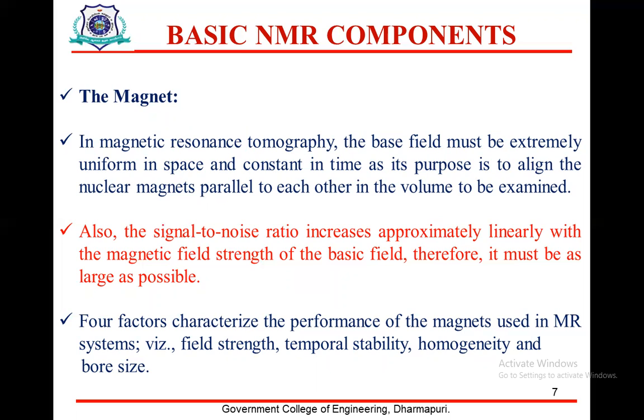Four factors characterize the performance of the magnets used in MR systems: field strength, temporal stability, homogeneity, and bore size.